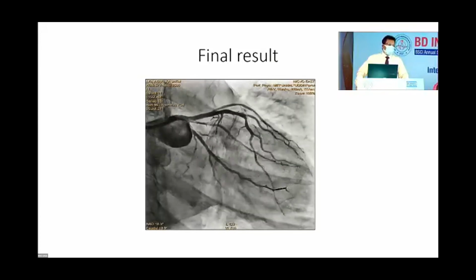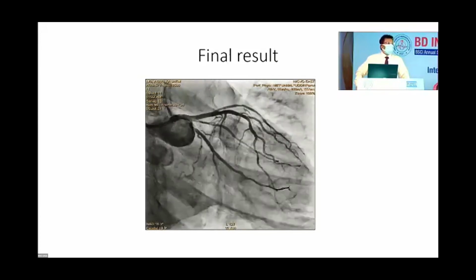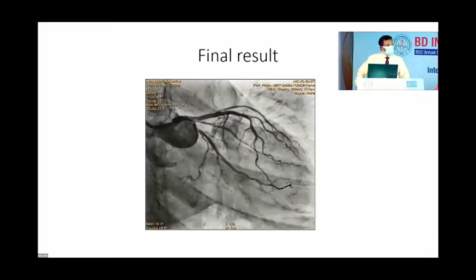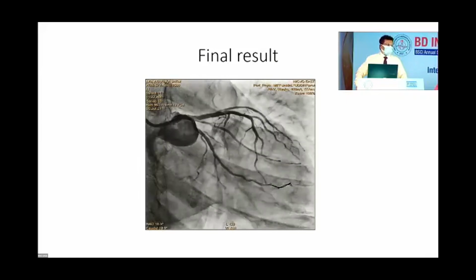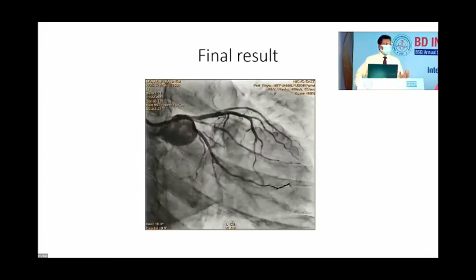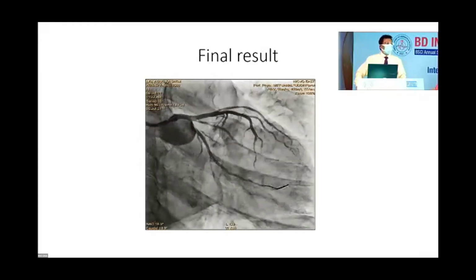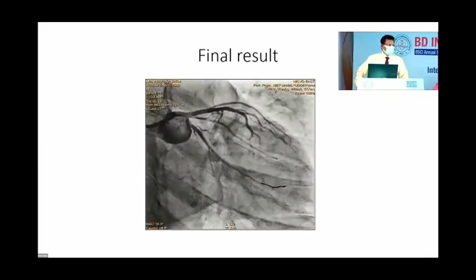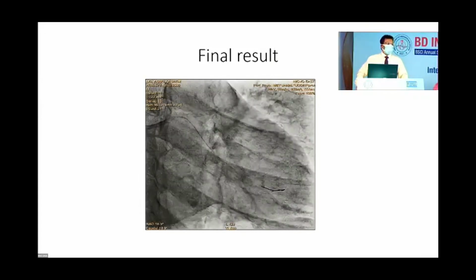I gave another wire, even then I could not deliver another stent or see by IVUS. But thank God, I am happy because it is well inflated in the left main, though a bit more hanging in the aorta. It is well inflated in the LM, keeping TIMI 3 flow in the left circumflex and left anterior descending artery, with good hemodynamics. So I finished it here.